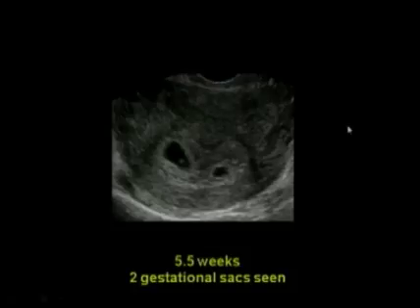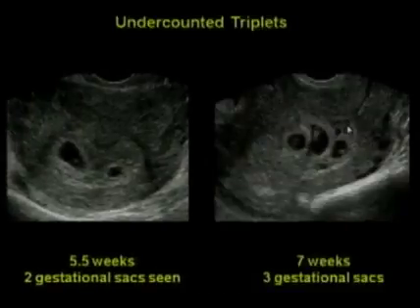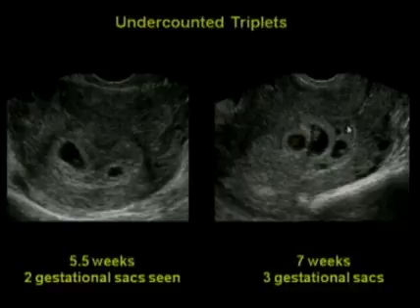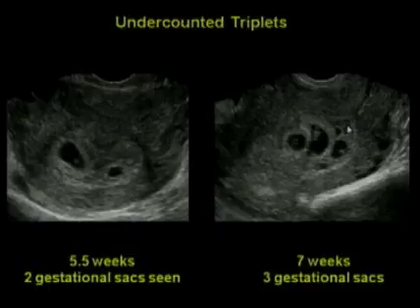There's another case: five and a half weeks, two gestational sacs seen. About a week and a half later — whoops — there aren't two, there's three. These kinds of appearing twins or appearing fetuses are not that uncommon.